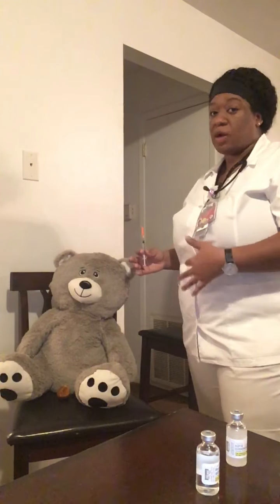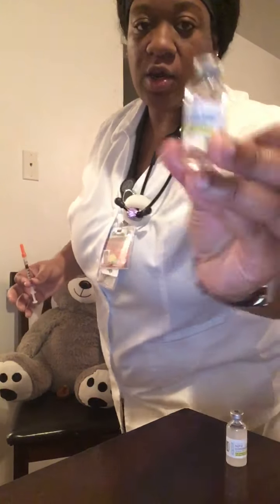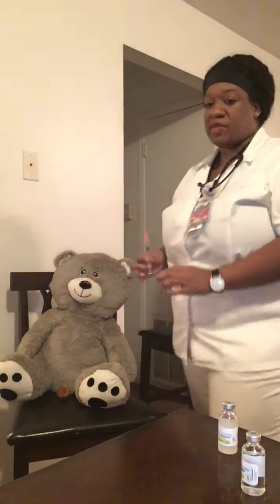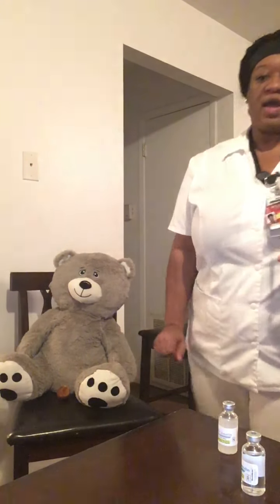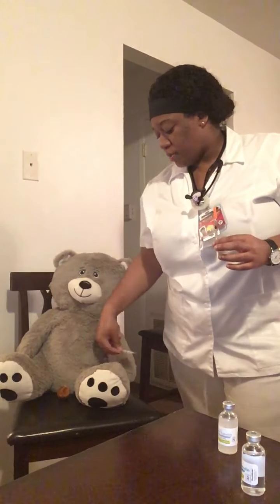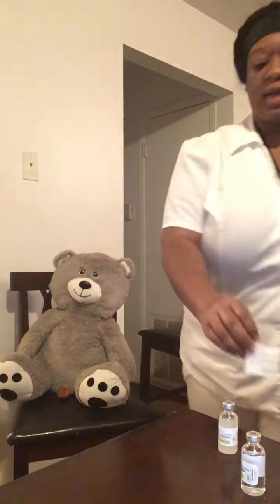For safety, I will ask the patient to state their name and date of birth once more, just to be sure again. The patient stated their name and date of birth. We're going to do our third check here. Regular, NPH. Again, the patient stated that they want their thigh area, so I am going to clean with my alcohol swab here. We're going to clean in a circular motion. Allow it to dry.